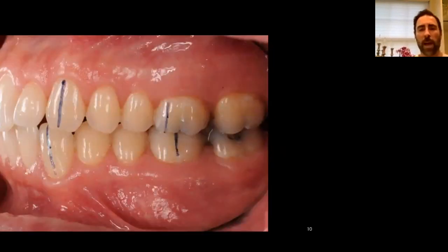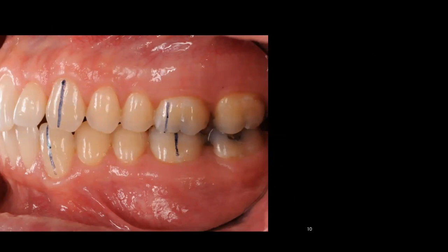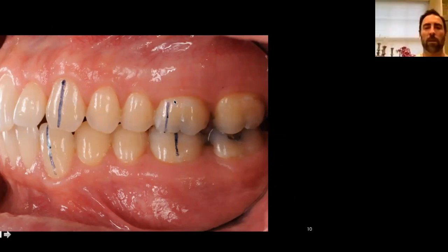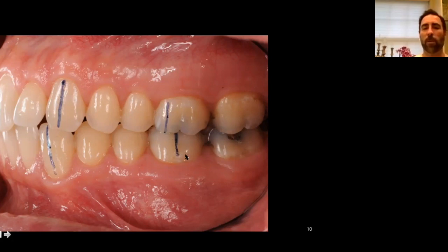This is what every lateral arch shot should look like. If your images don't look like this, this is what you're supposed to be shooting for. I've drawn a little marker onto the molars and onto the cuspids, showing what a class one should look like — where the lines are drawn down the middle of the cuspids and where the mesial buccal cusp of the molar is.